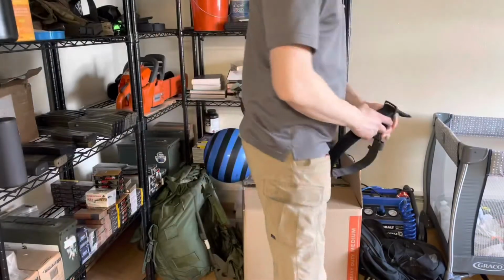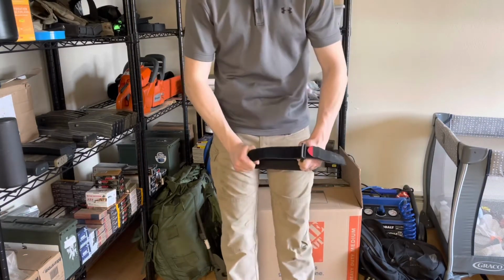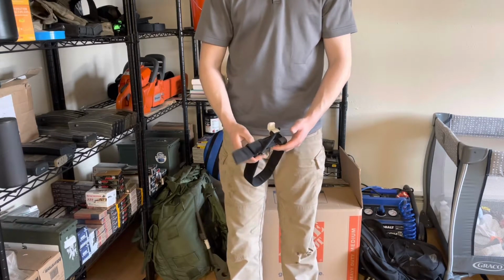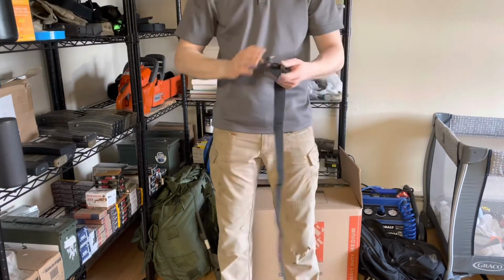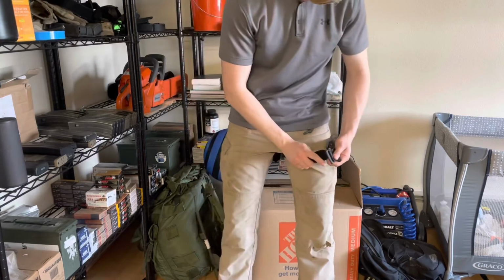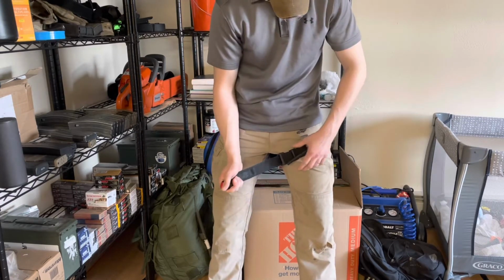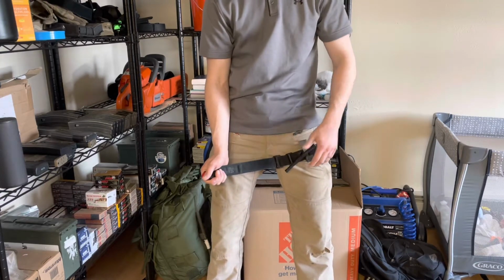Alright guys, so now we're going to go over how I go about self-application of a tourniquet on a leg. So this is really simple. Again, we're using the earlier generation CAT tourniquet set up to simulate a Gen 7. I'll go ahead and show you on the Gen 7 first how the initial tightening goes, just to make it easier to, I guess, more relative. But basically, you're going to get this plate somewhere that you can actually get to the windlass and have effective access and spinning capacity on the windlass.